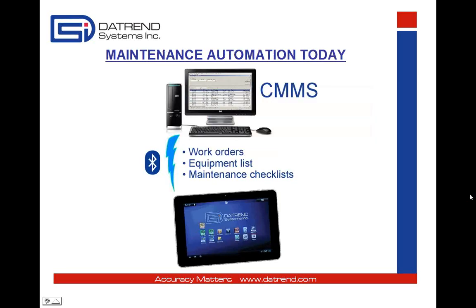This new technology relies on piggybacking on existing CMMS infrastructure, the MedTester system, while at the same time expands its capability with a mobile computing device, such as a tablet. It's similar in principle to a MedTester, but it's more advanced. Exactly how it works is going to depend on the CMMS that's in use. So here's the first situation.